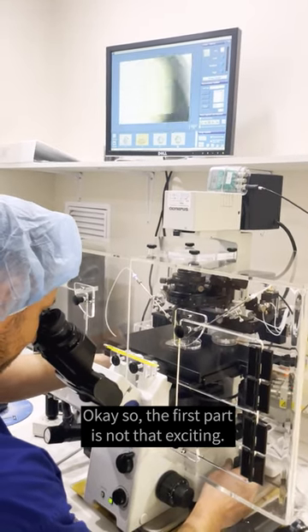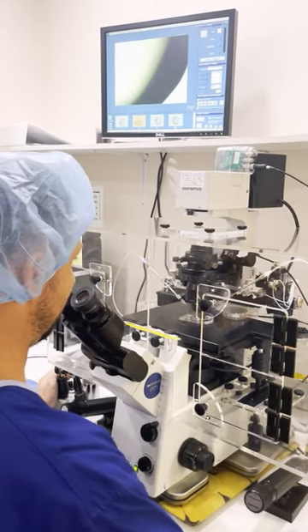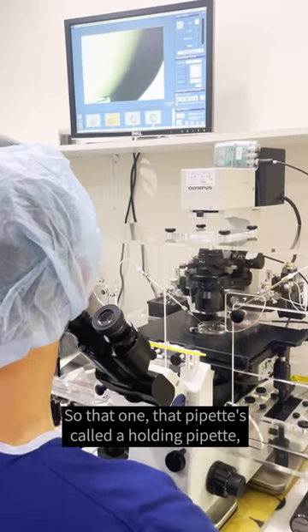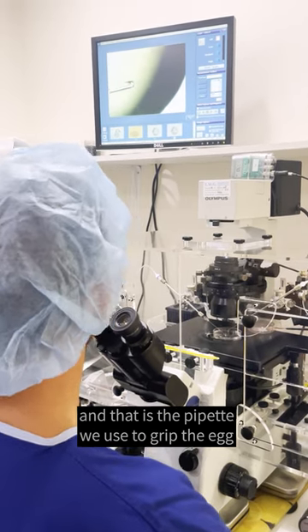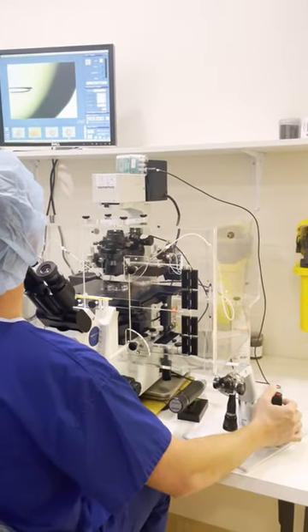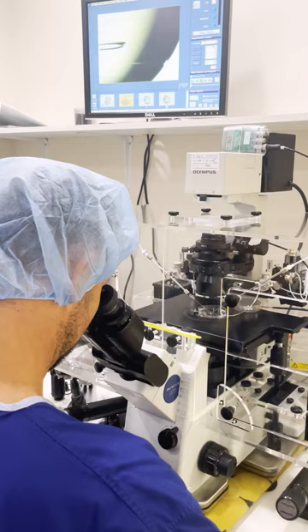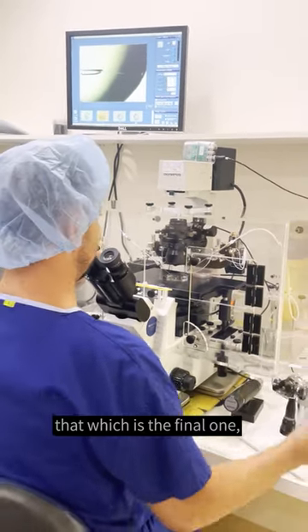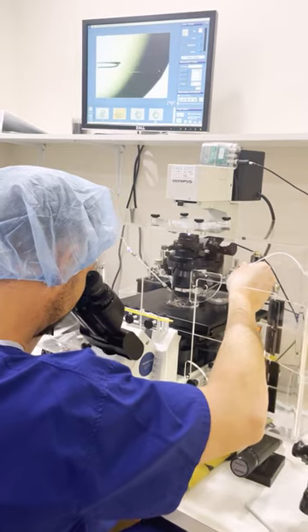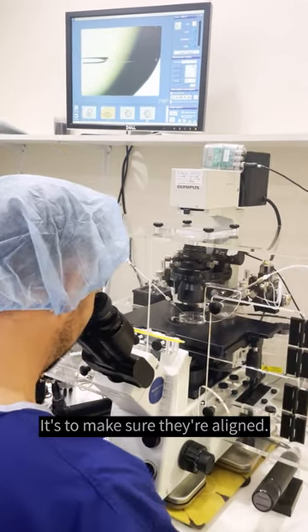The first part is not that exciting — we just have to align our pipettes to make sure that they're lined up. That pipette is called the holding pipette, and that is the pipette we use to grip the egg and keep it steady during the injection. And then the second one is what we call the injection pipette, and that's the one we use to inject the sperm into the egg. Just make sure they're aligned.